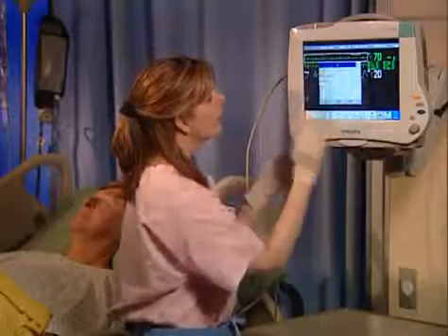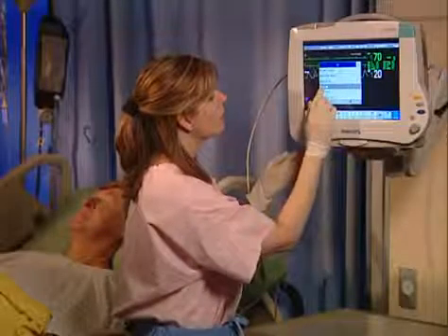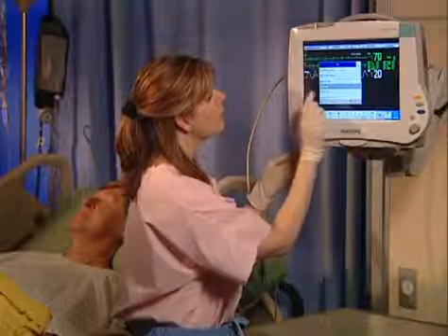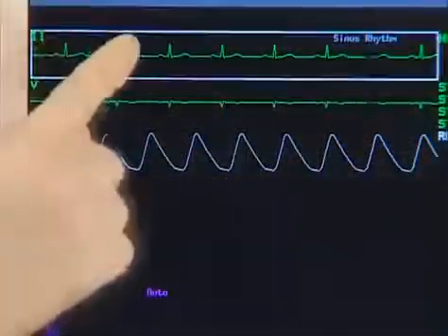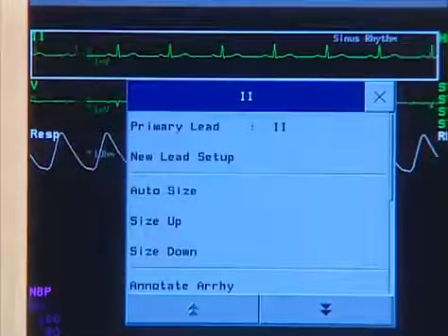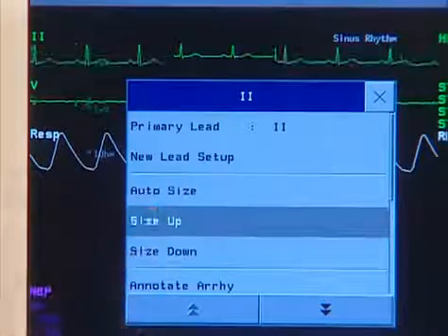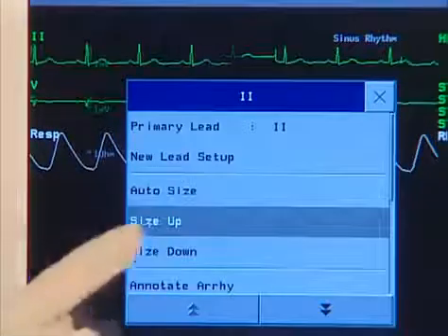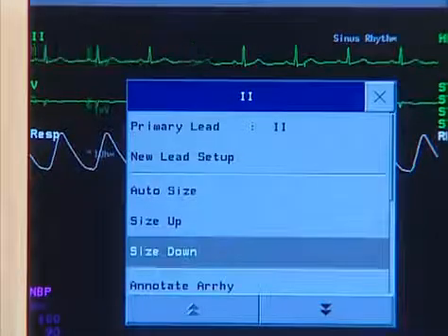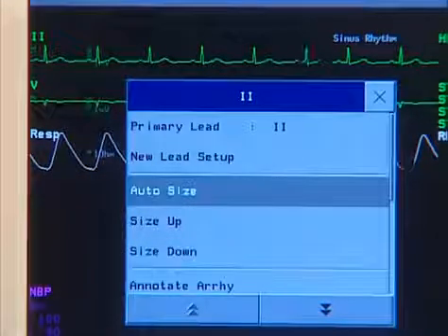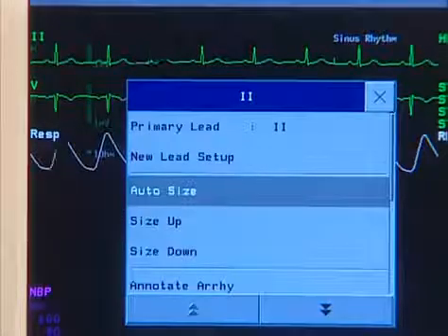If any of the displayed ECG waves are too small or clipped, you can change the size of one or all of the ECG waves on the screen. Select the wave segment you want to change. In the wave menu, select size up to increase wave size or size down to decrease the size. Or you can select auto size to let the monitor choose the optimal adjustment factor for all displayed ECG waves.